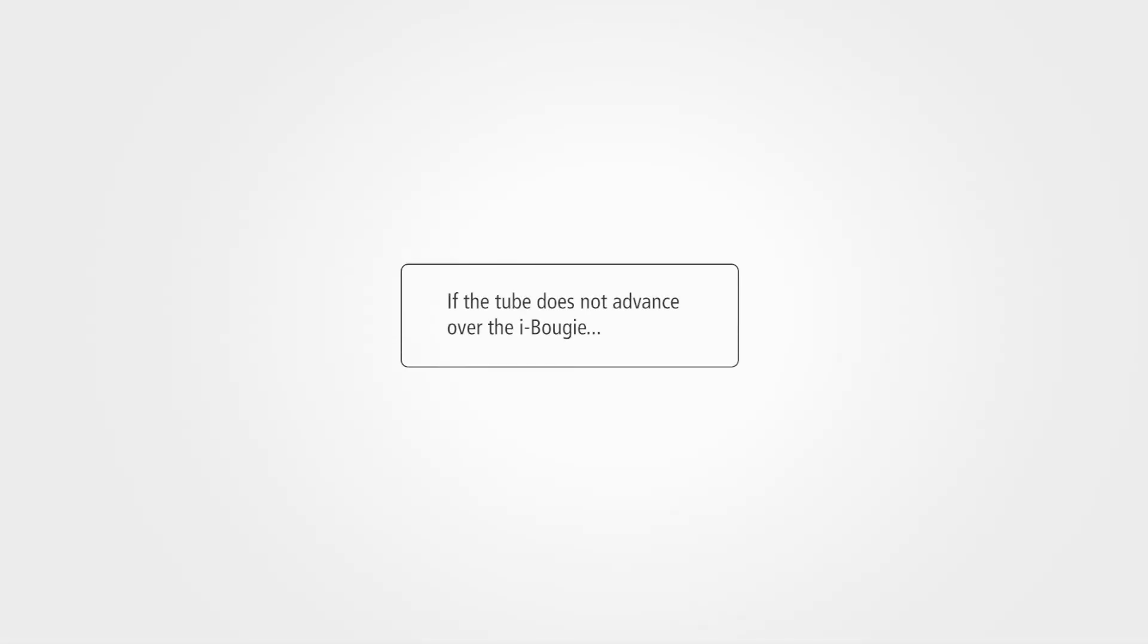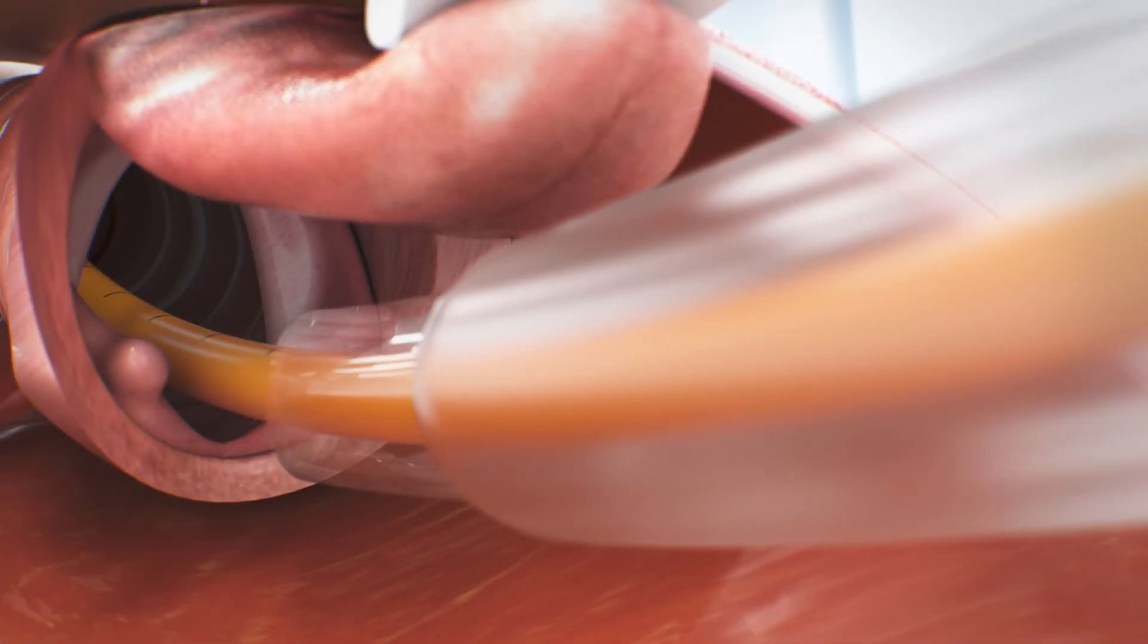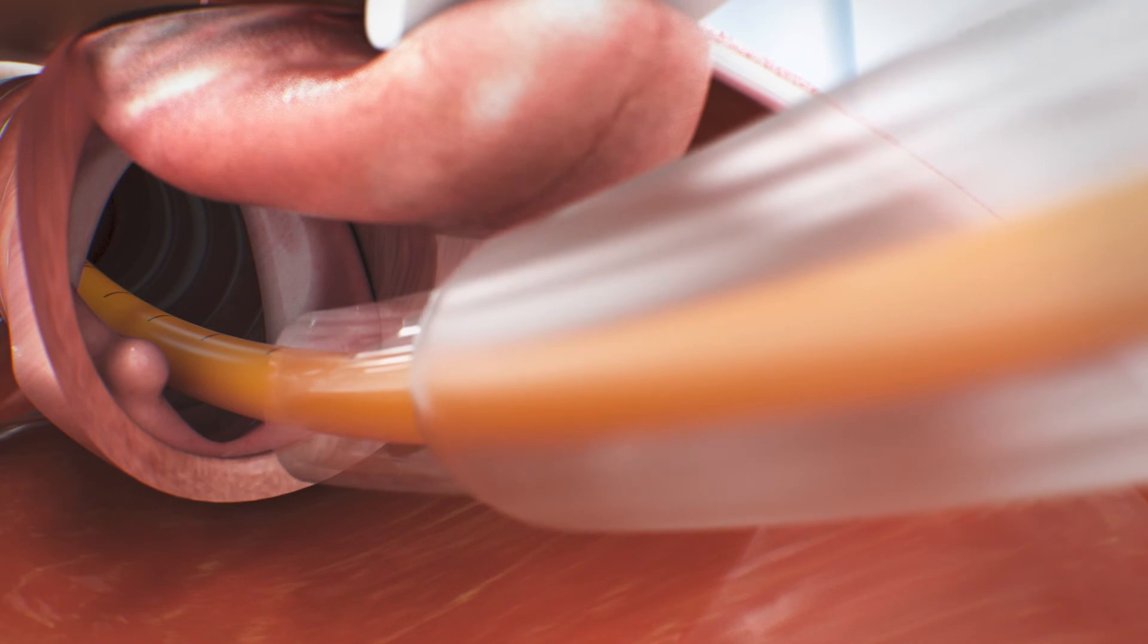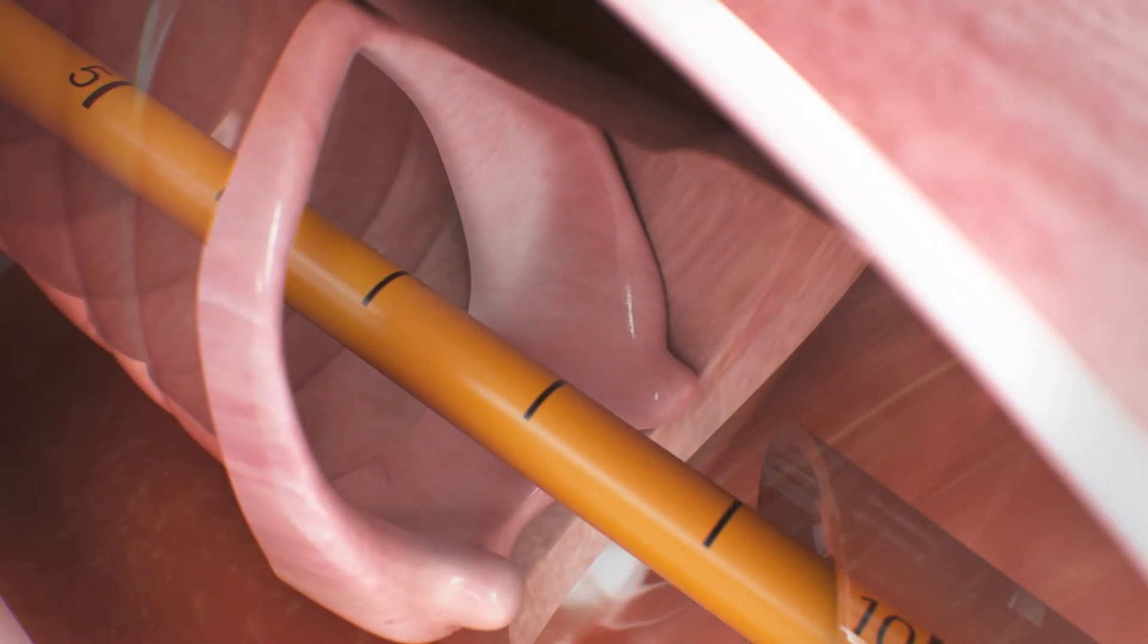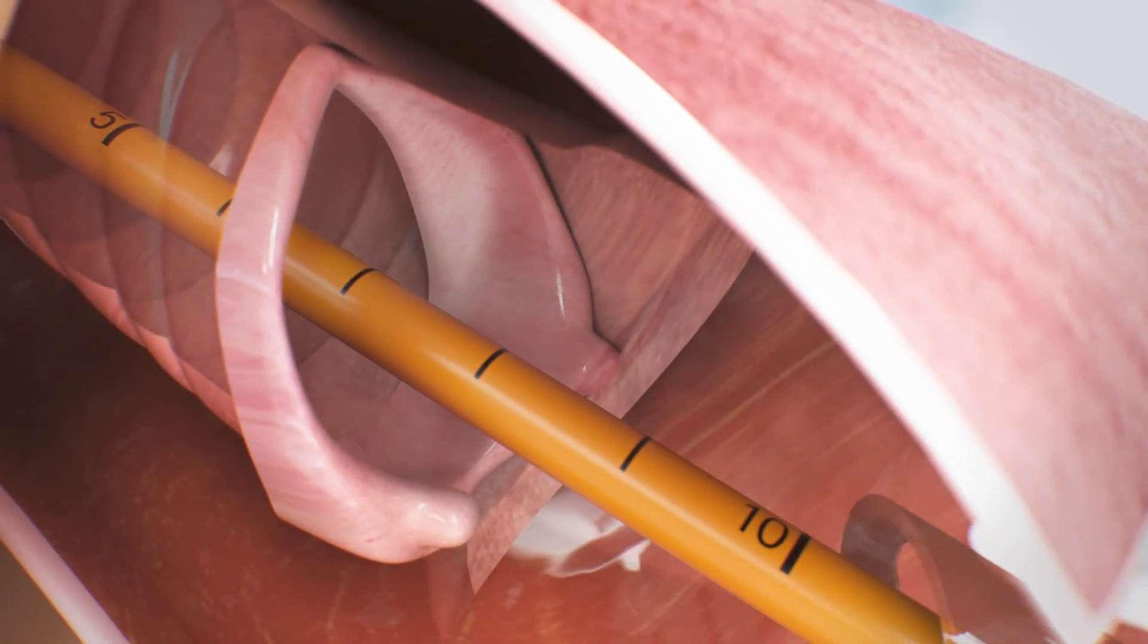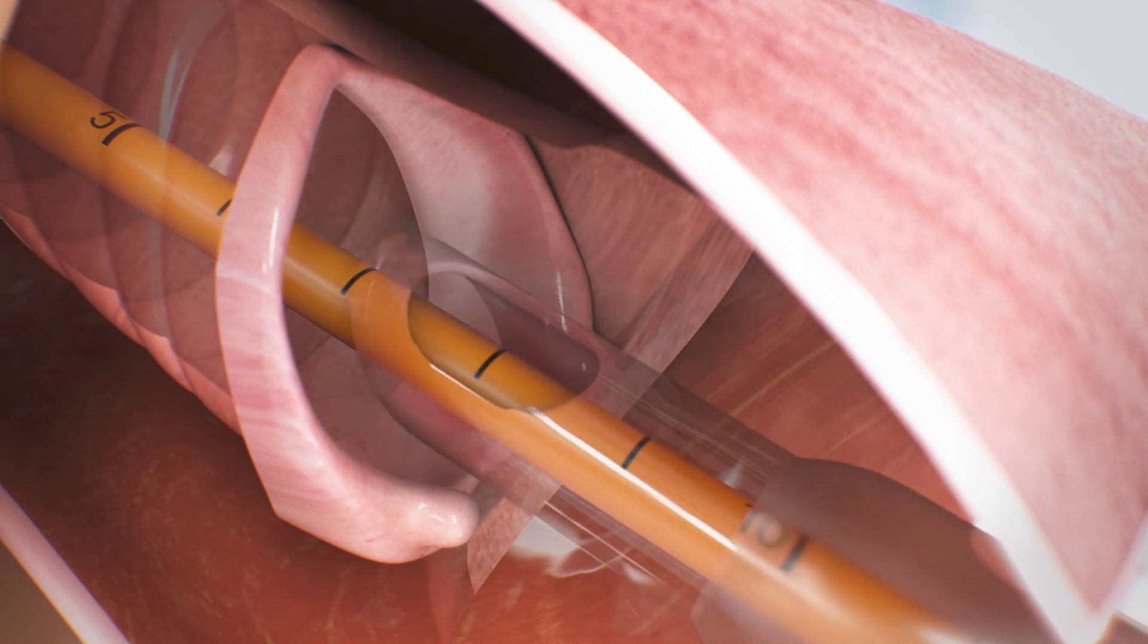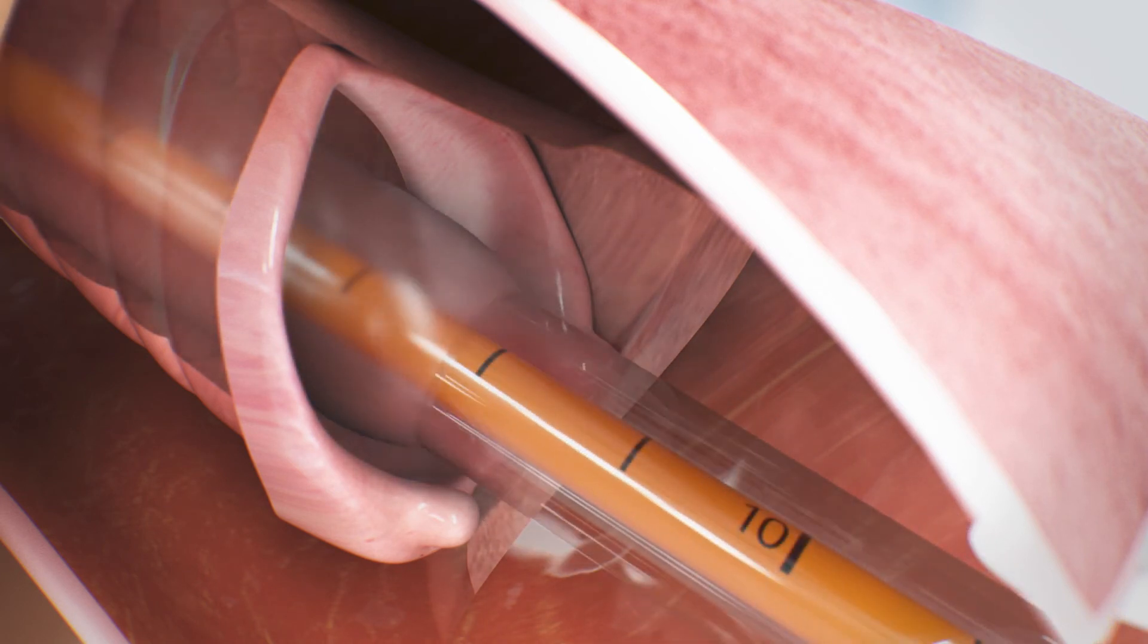If the tube does not advance over the EyeBougie, the beveled tip of the tube may have gotten caught in the arytenoids. In this case, pull back the tube about 2 cm and use a 90-degree anti-clockwise rotation to advance the tube through the vocal cords.